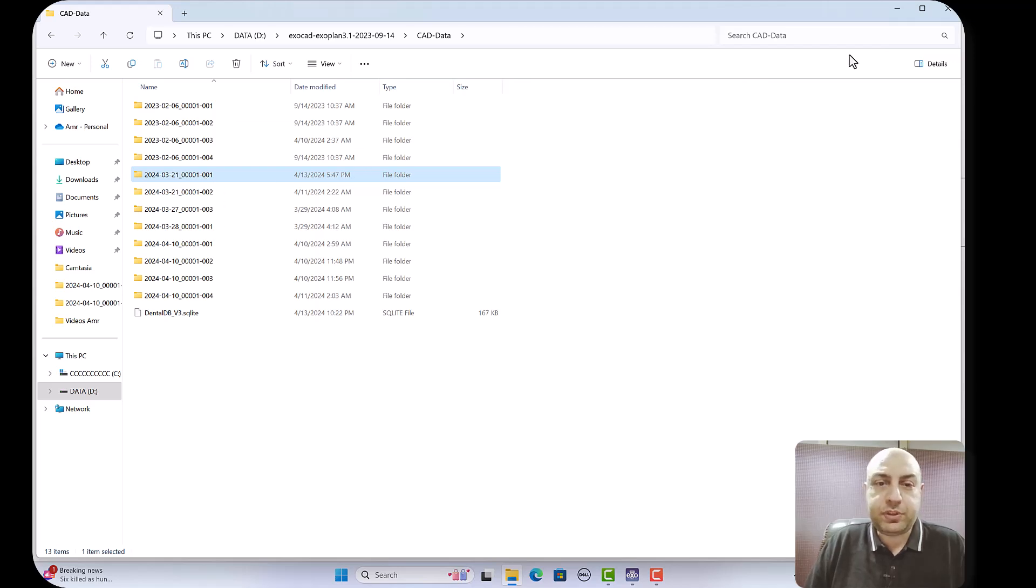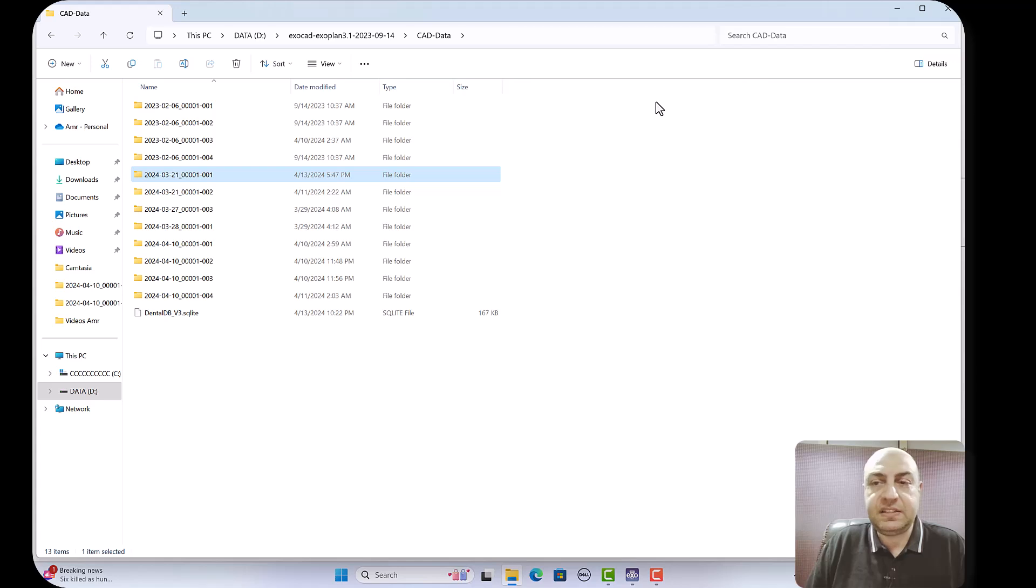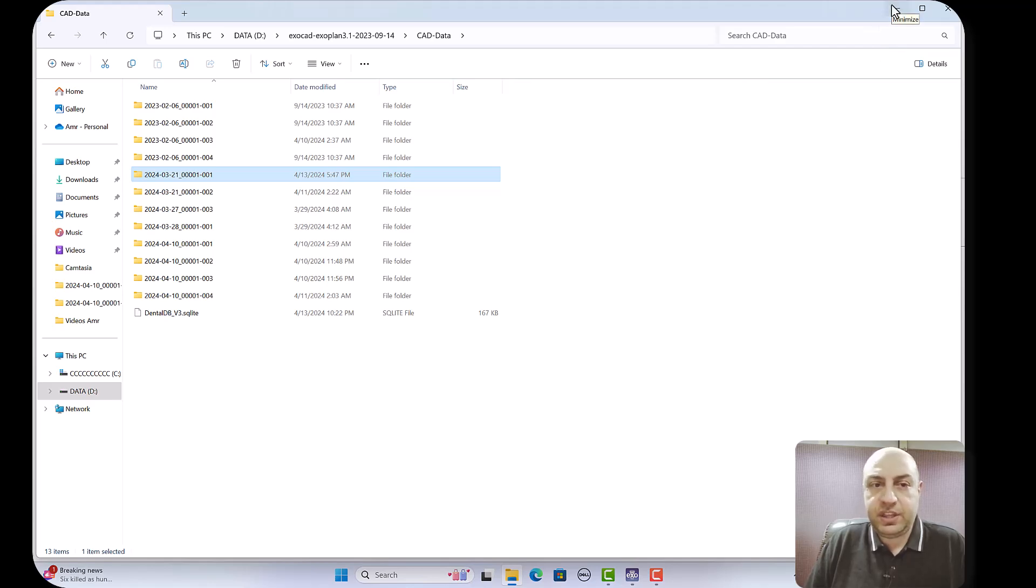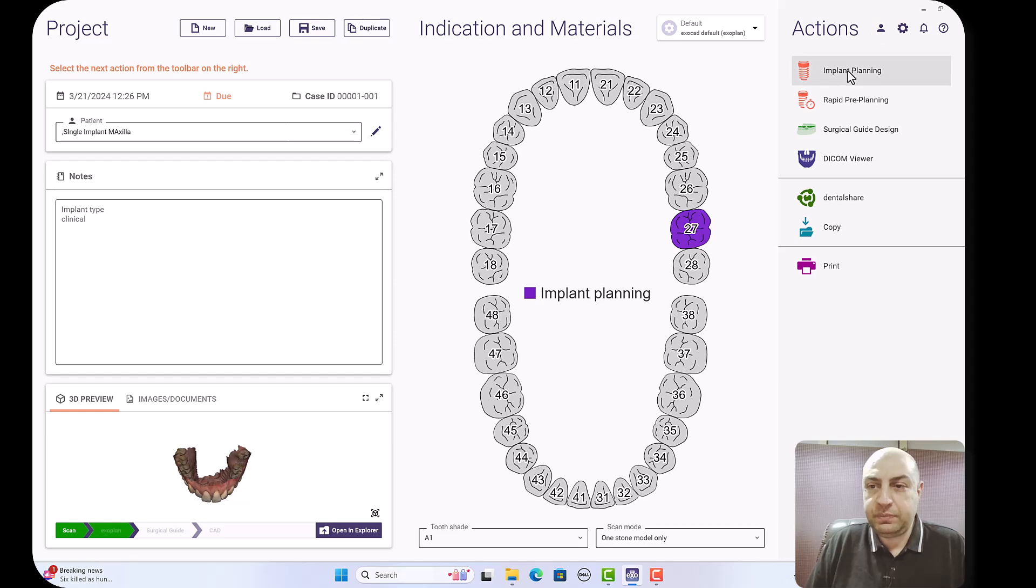This is one method. If you have an Exocad, copy it and place it in the database for the Exocad. If your lab has an Exocad and wants to integrate with you in the restoration, you can go through DentalShare.